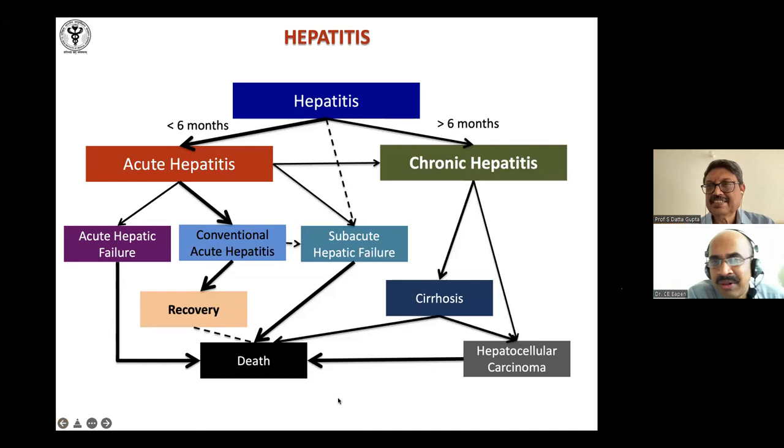Deepak Kumar: How do reticulin and Masson trichrome differ in staining for collagen? The type of collagen stained by reticulin is different. There are different types of collagen: collagen 1, 2, 3, 4, 5, 6, and so on. Reticulin stains a specific type of collagen found especially in the basement membrane, lining vessels, lining capillaries, and so on.